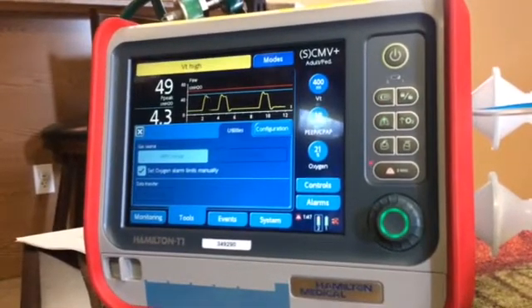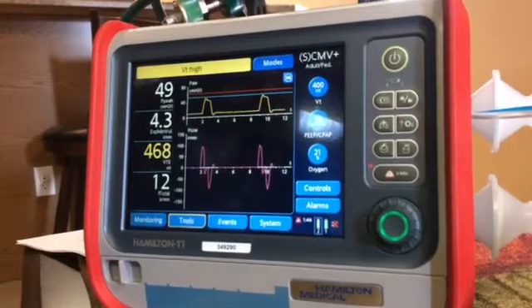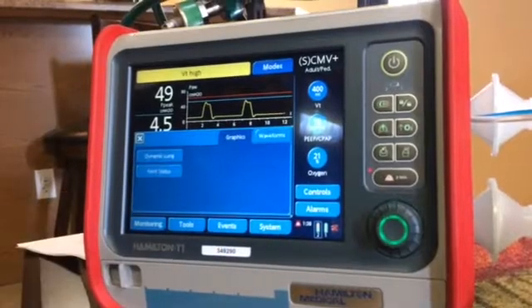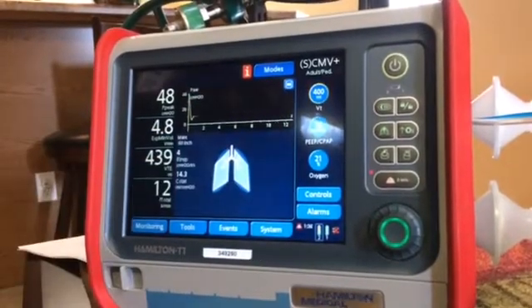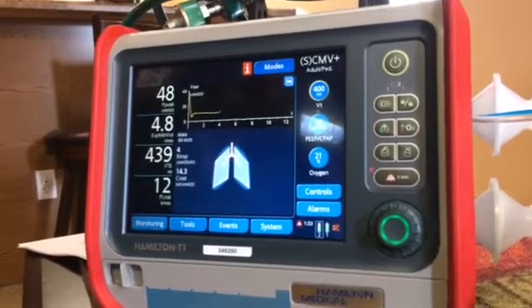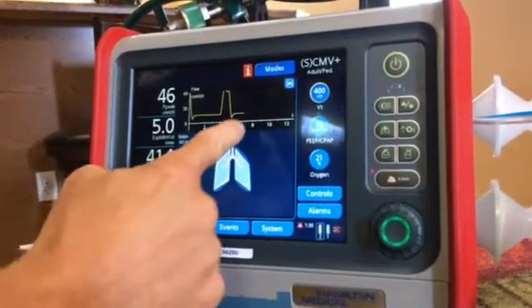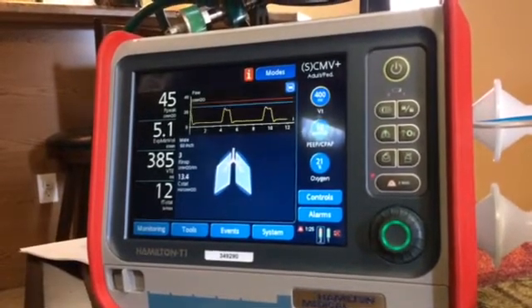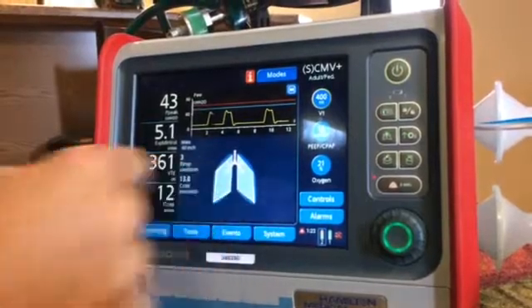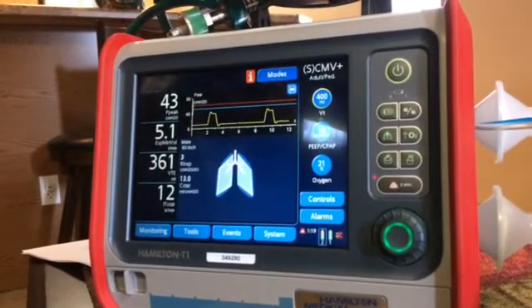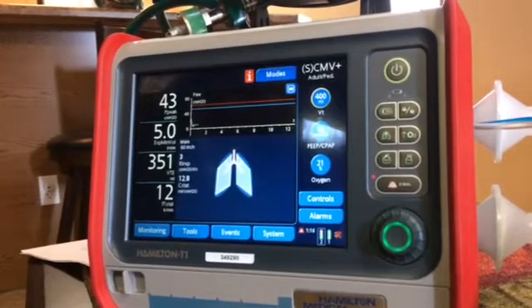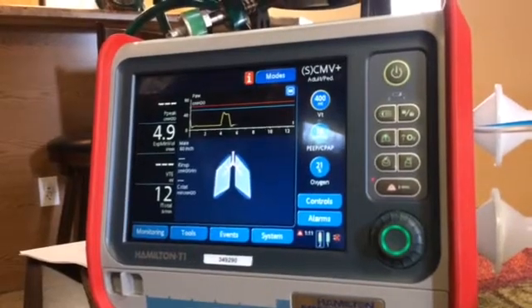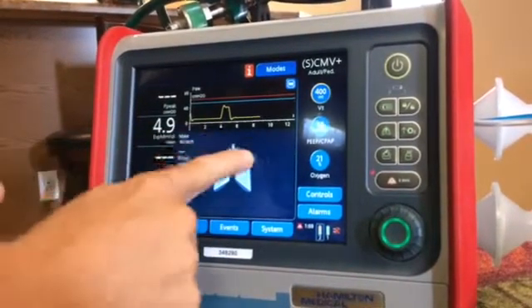If you go to Tools, you can go to Configurations, though we really don't do much with the Tool mode. If you touch the screen, you can go to Waveforms, Graphics, or do a Dynamic Lung — it will actually show you your lung. If the airway is tight, the tracheal bronchial tree will turn red indicating bronchospasm. If the lung lights up at the bottom portion, it indicates decreased lung compliance, which you might see in patients with ARDS, acute bronchospasm, or significantly bad lungs.